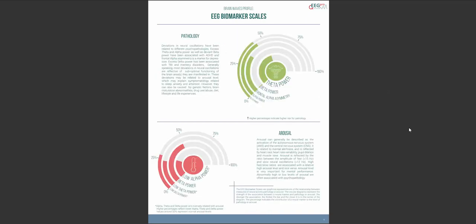The next page shows the EEG biomarker scales, which gives you a bit more detail about what deviations have been found. The top graph shows the pathology scales. As you can see there is theta power, beta power, frontal alpha asymmetry, alpha power and delta power. Even though there are scientific literature linking deviations in all of these measures to pathology, there is a difference in the amount of scientific support. This is depicted in this graph in two ways.